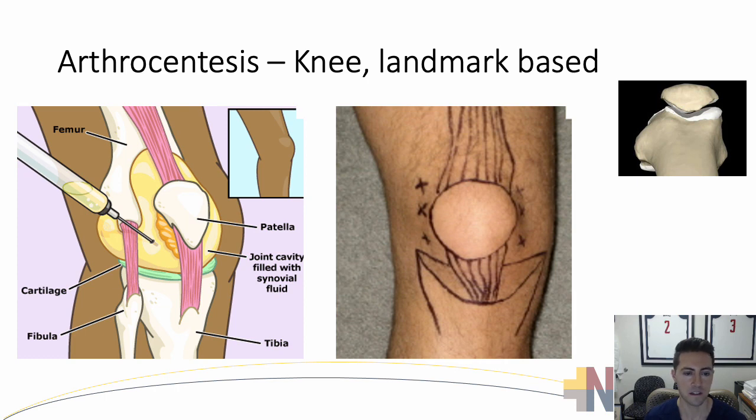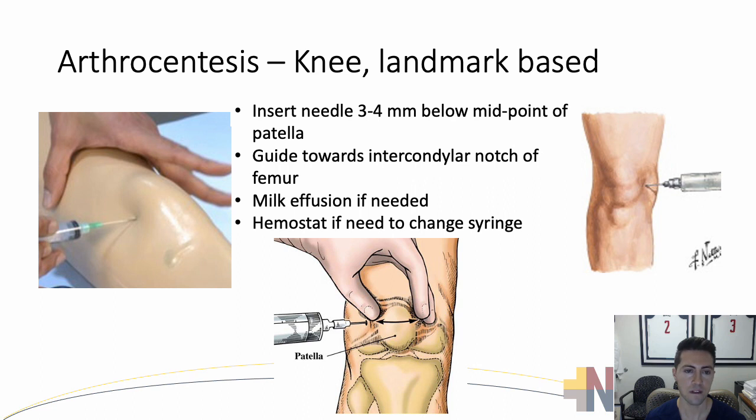Here's an arthrocentesis demonstration that's landmark-based. There are several markings on the patient with the anatomy outlined in pen on the skin, and several access points. We're going to go over the mid-patellar approach. You insert the needle about three to four millimeters below the midpoint of the patella and guide the needle towards the intercondylar notch of the femur. You can milk the effusion if needed to gain easier access. Sometimes you'll use a hemostat if you need to switch off the syringe and insert another syringe or use a different culture bottle for sending to the lab.